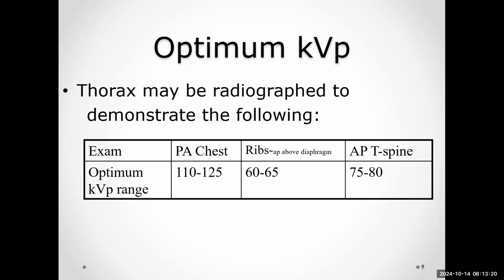We want to be able to have a little bit lower contrast. So remember, I said low contrast is not a bad thing. It's just when contrast is lower because of scatter, then it's a bad thing. But just low contrast in general, sometimes we want to see, like in the chest.